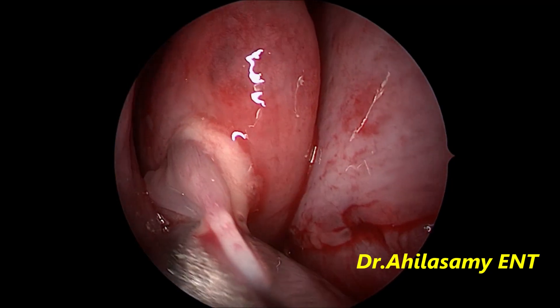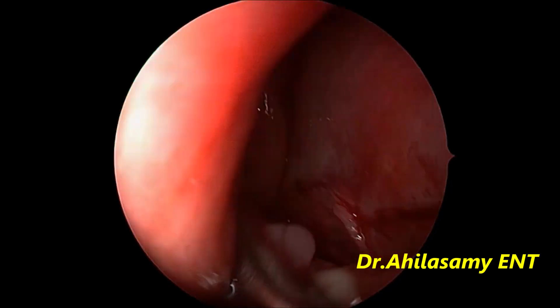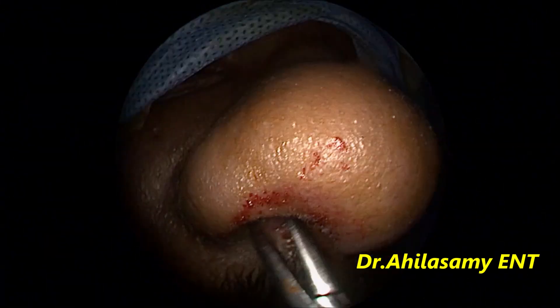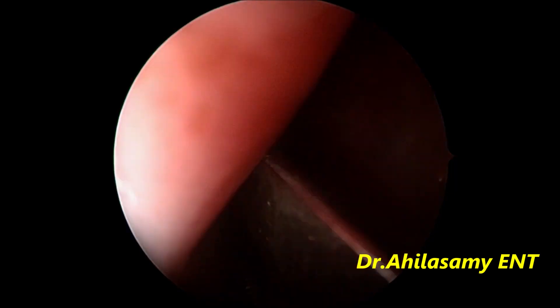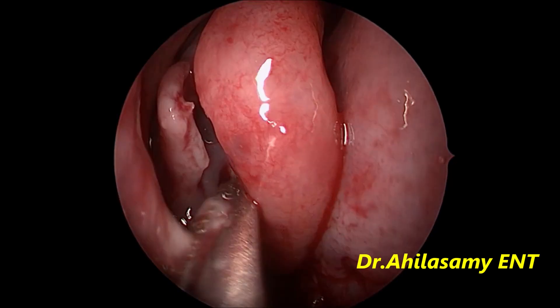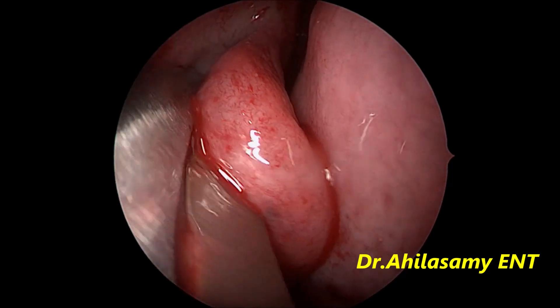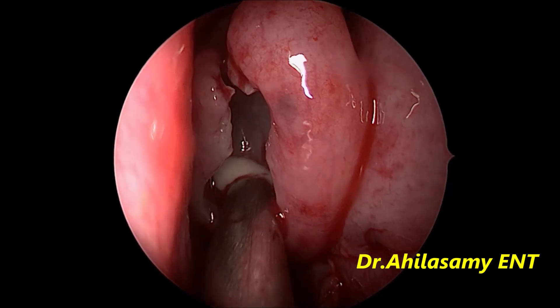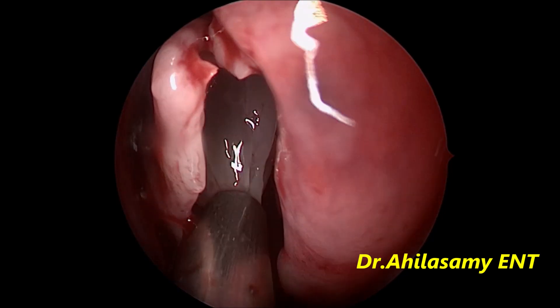I am just removing the polyp to show it in a better way — it is arising from the right accessory ostium. Taking it out with the back-biting forceps, it is a huge polyp. This patient also has a gross septal deviation. My assistant doctor has already done a septal correction before I started this surgery — cross-correction to the right side, which has been corrected. You can also see there is pus inside the concha bullosa cavity.